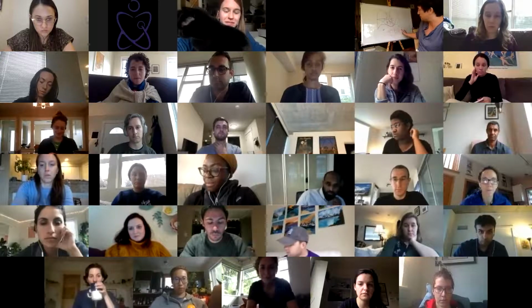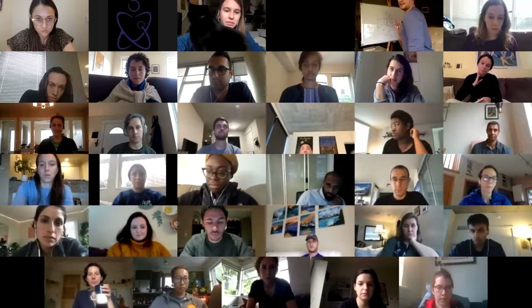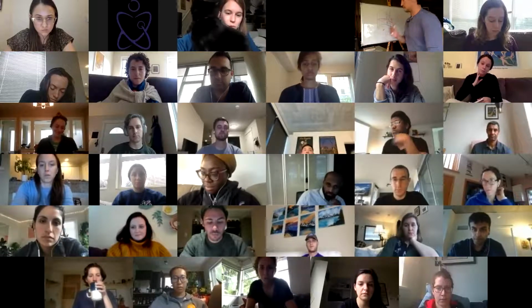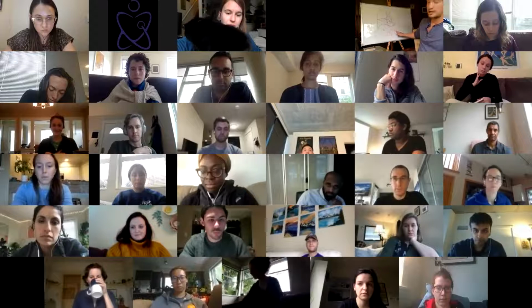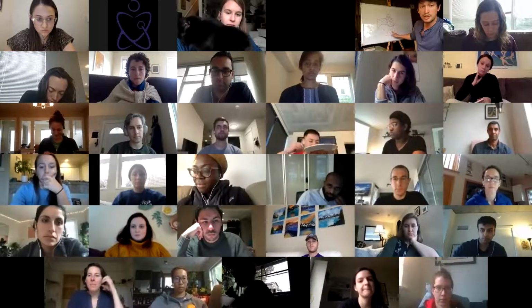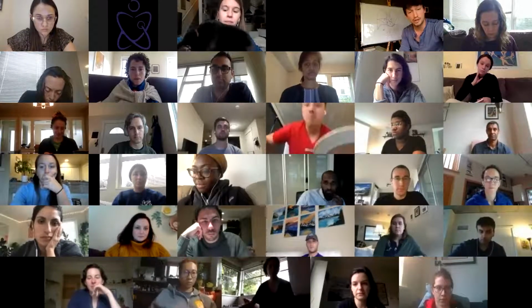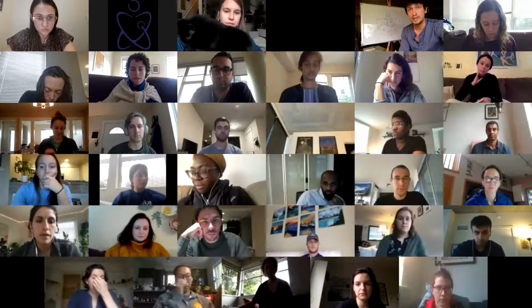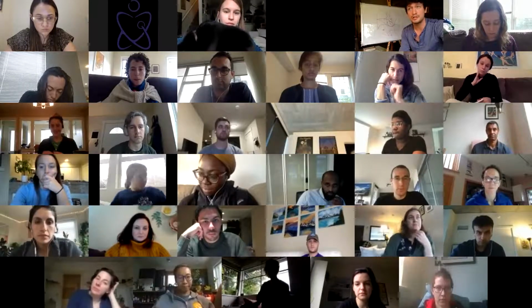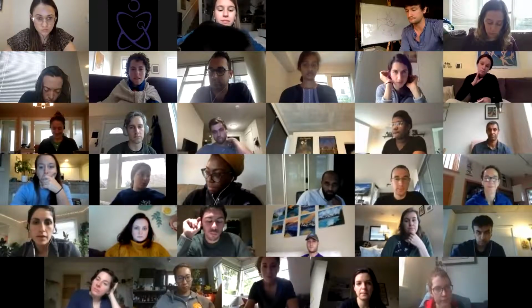Whereas if you have a PA, the patient's going to be right against the film, and so the heart's going to look a lot truer to size. The mediastinum might also look a little bigger on the AP view. So that's a tricky thing that some people can get messed up on and call cardiomegaly or pulmonary edema when there actually isn't any.